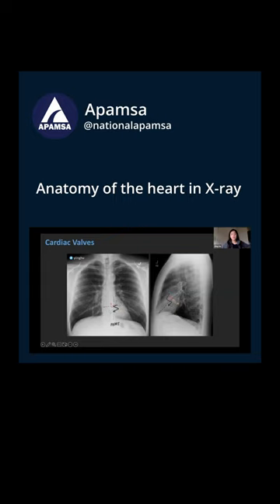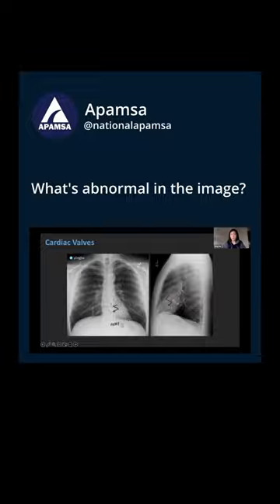You can tell which valve is which based on the angle of the valve replacements that you see. You obviously cannot see the valves themselves on a regular chest X-ray.